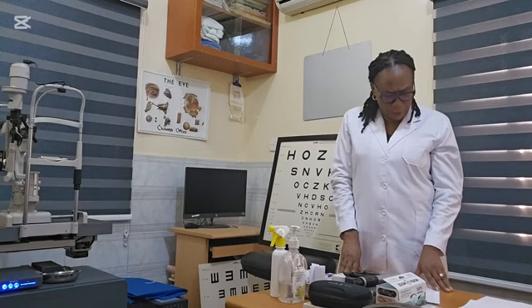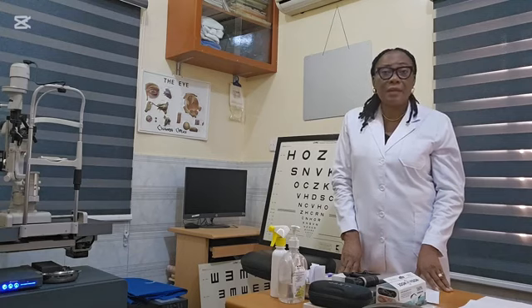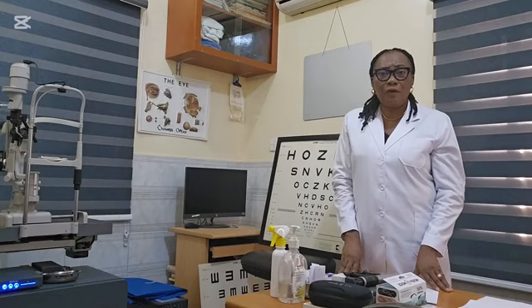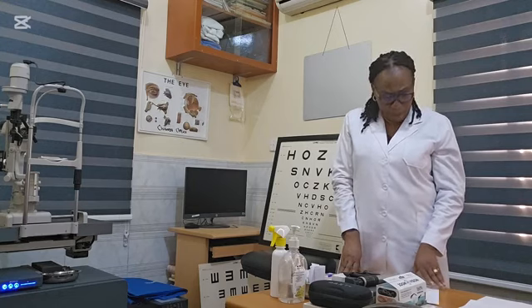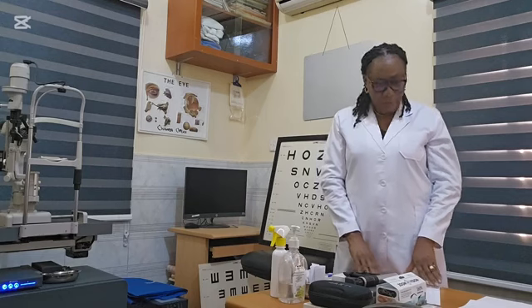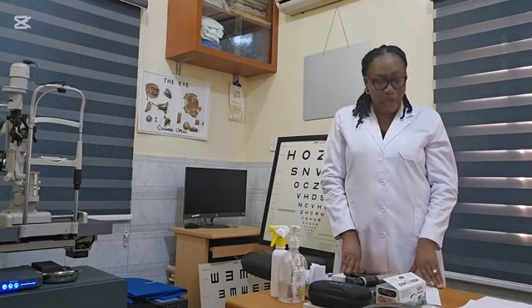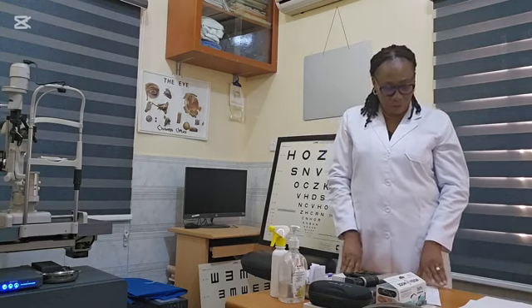So today I'm going to evaluate a 14 years old patient, a female student, who has been referred to a facility for a low vision evaluation. The cause of low vision was diagnosed to be amblyopia and macular dystrophy. In the assessment today, we are going to assess her needs, do a preclinical evaluation, and also dispense appropriate low vision devices that will be acceptable for the patient.